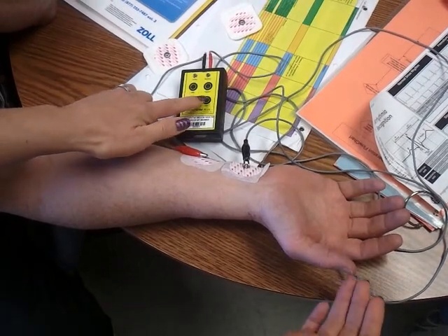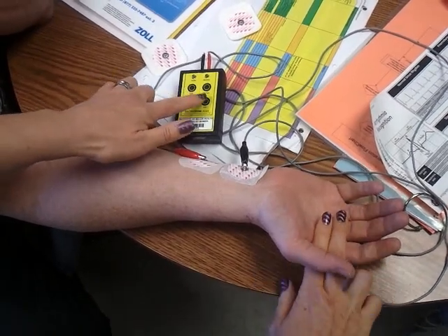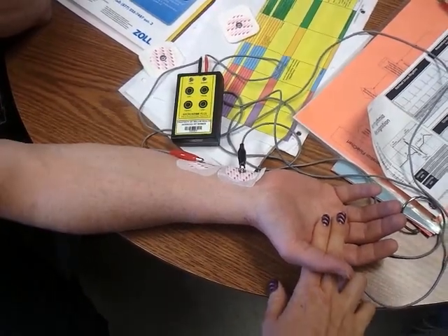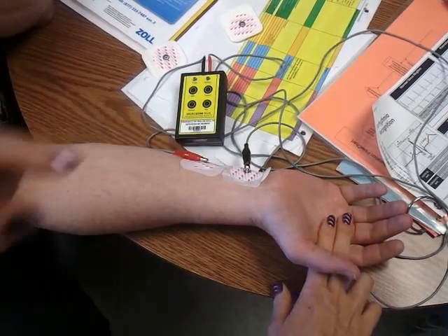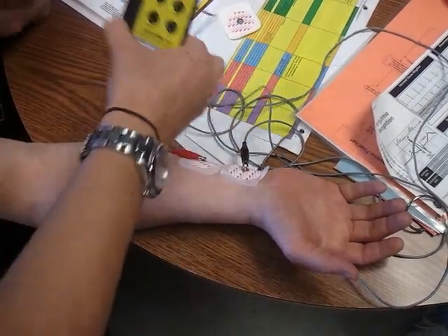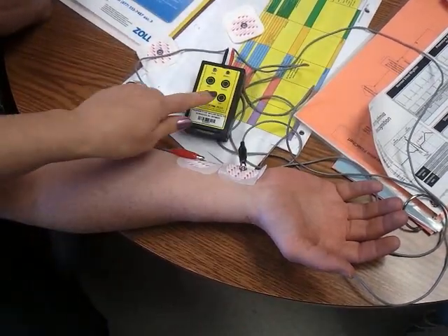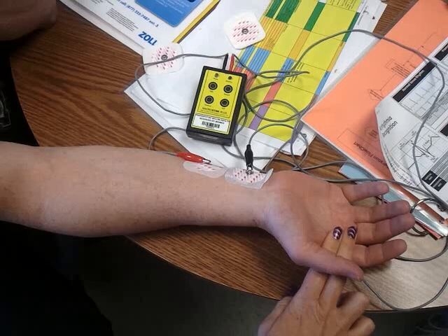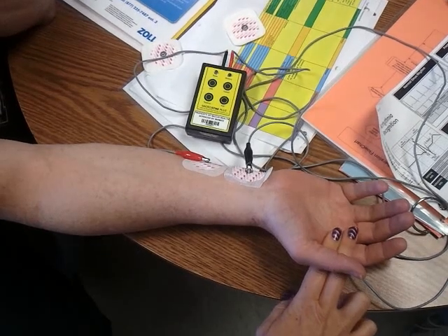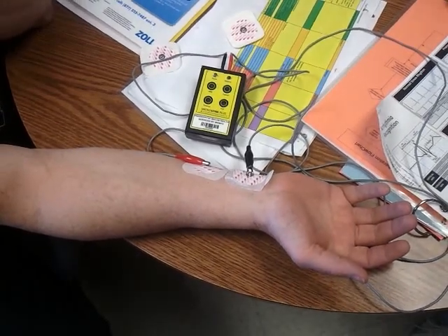Alright. We see his pinky. Okay. So we're getting there. So it has to be the thumb. Yep. We want the thumb. Alright. So number five. Oh, yeah. There you go. Alright. You can definitely see it at a five. Four twitches at five.